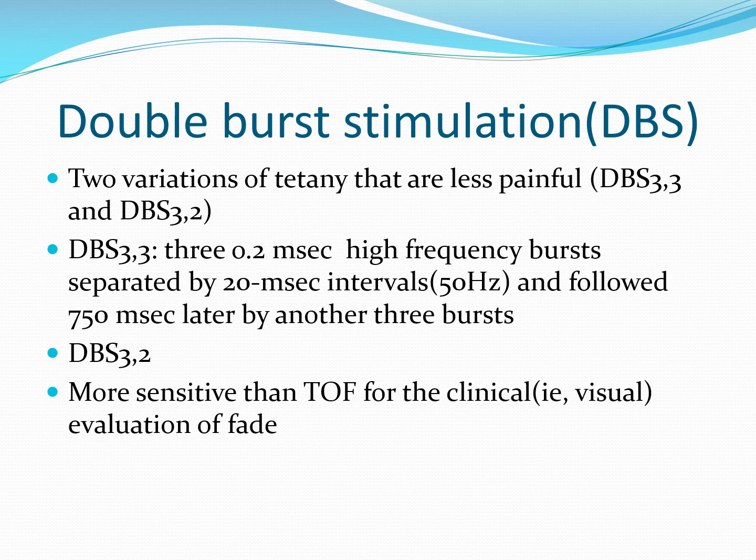750 milliseconds later by another 3 bursts. In double burst stimulation 3 and 2, it's similar to double burst stimulation 3 and 3, but the first 3 bursts are followed by 2 bursts instead of 3. Double burst stimulation is more sensitive than train of four for the clinical evaluation of fade, we mean visual or tactile.